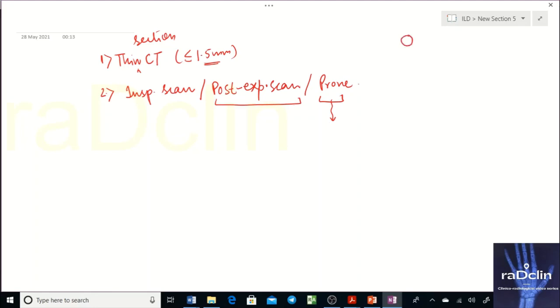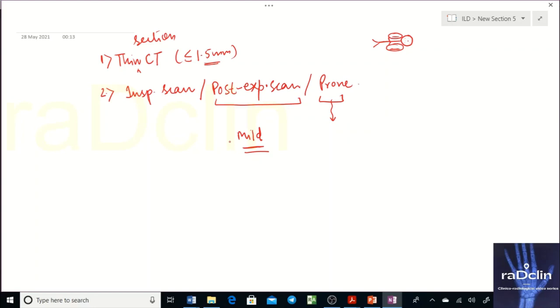When the patient is supine, the dependent — posterior — parts of the lungs become atelectatic. In UIP, the lung bases and subpleural areas are typically involved, which are exactly the same posterior basal areas that become atelectatic on a supine scan.